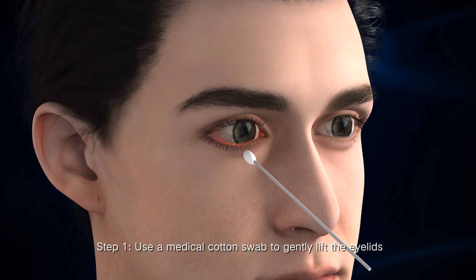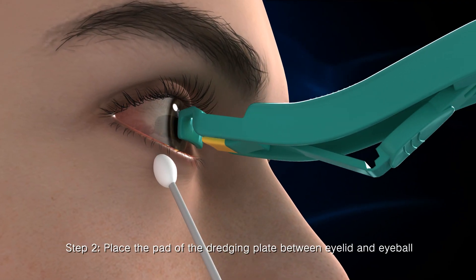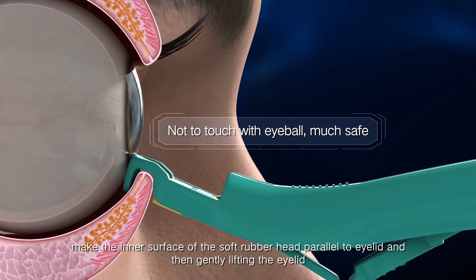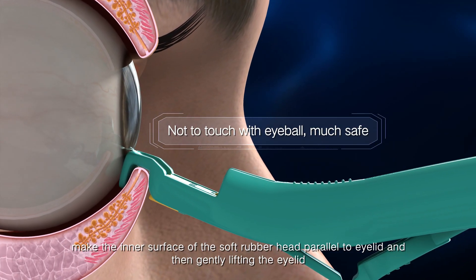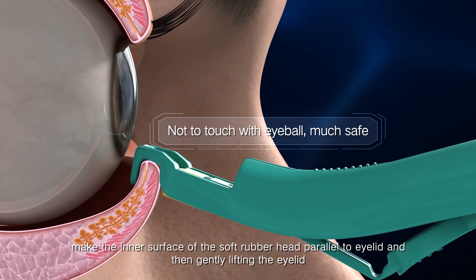Step 1: Use a medical cotton swab to gently lift the eyelids. Step 2: Place the pad of the dredging plate between the eyelid and eyeball. Make the inner surface of the soft rubber head parallel to the eyelid, then gently lift the eyelid.